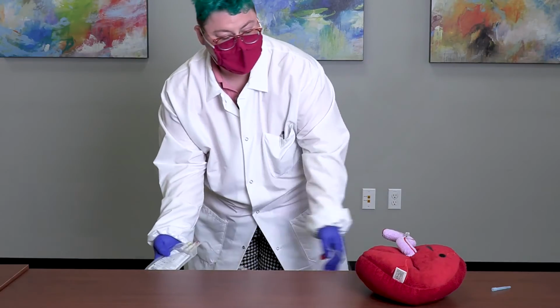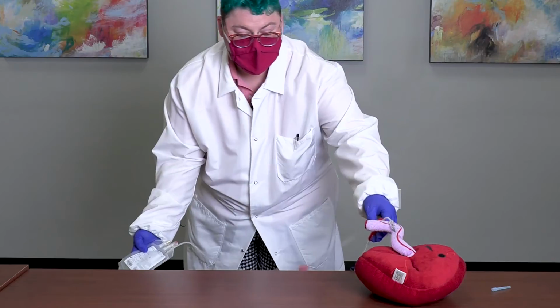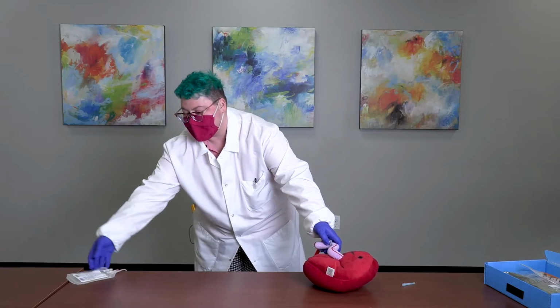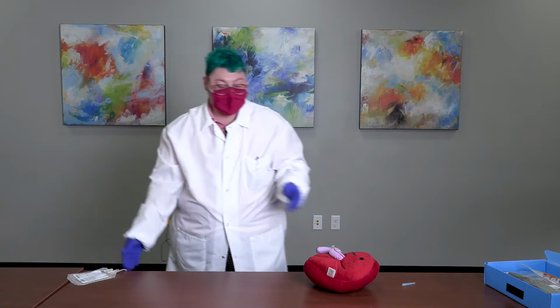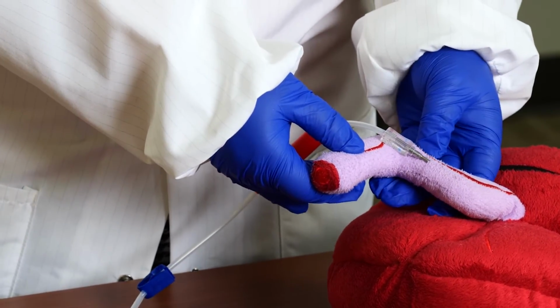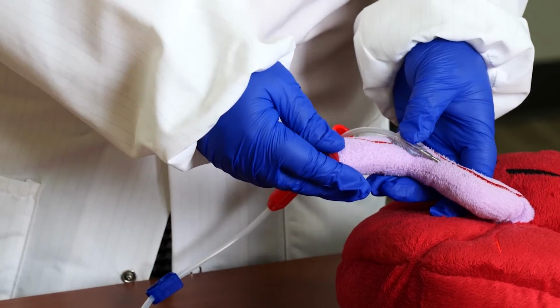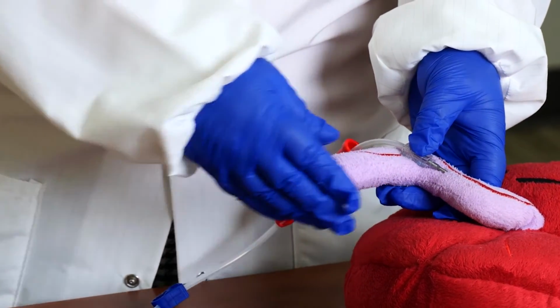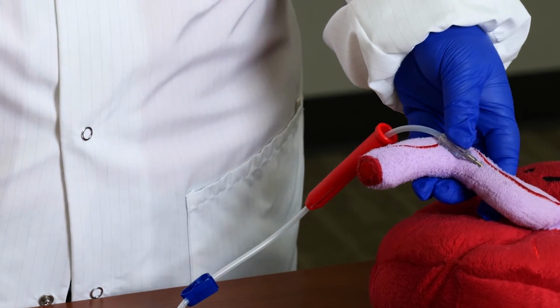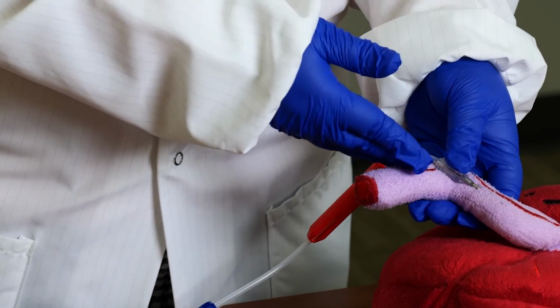lower the bag below the collection location. This can be dropped off to the side and can be rocked gently by a circulating nurse. Once the umbilical cord stops pulsing and blanches white, it'll be ready for removal. We do encourage you to wait as long as possible after beginning the collection until stopping it.